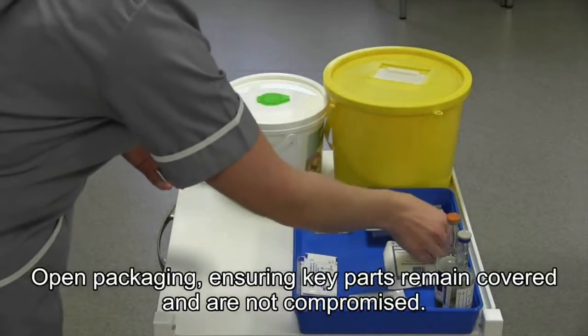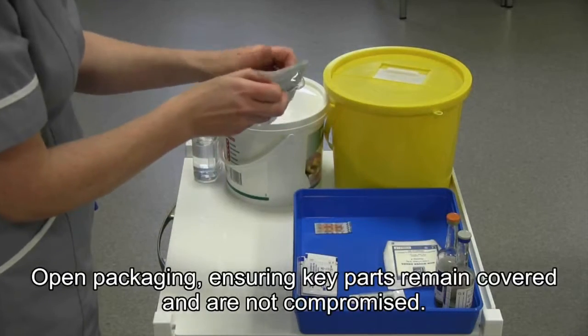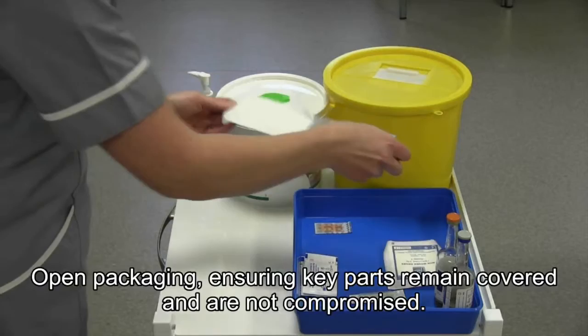Next, open packaging, ensuring key parts remain covered and are not compromised.